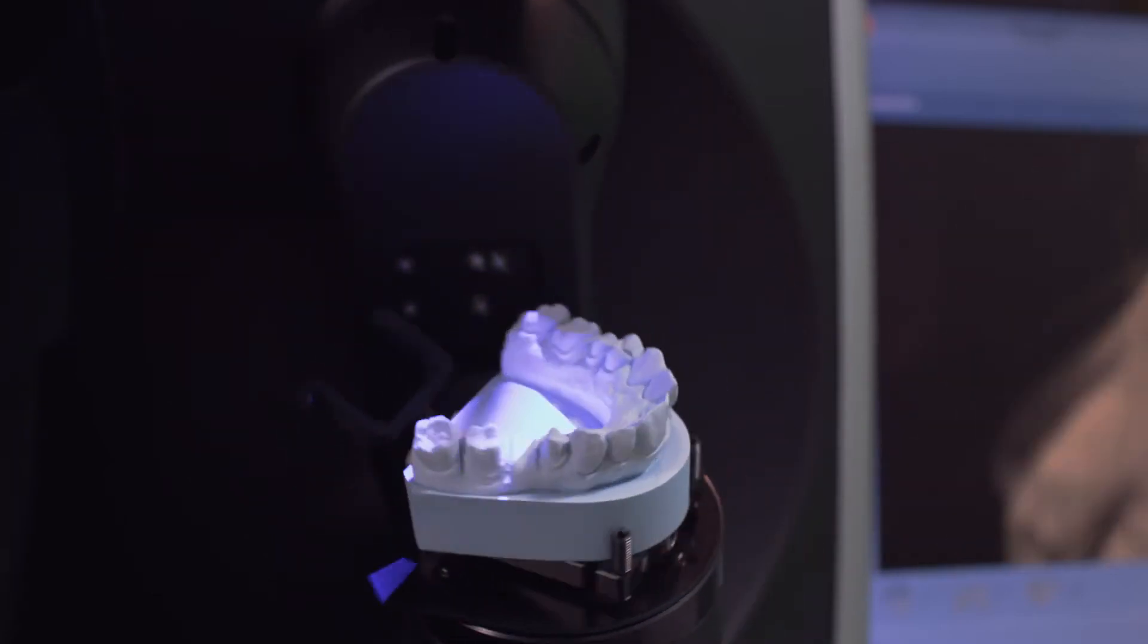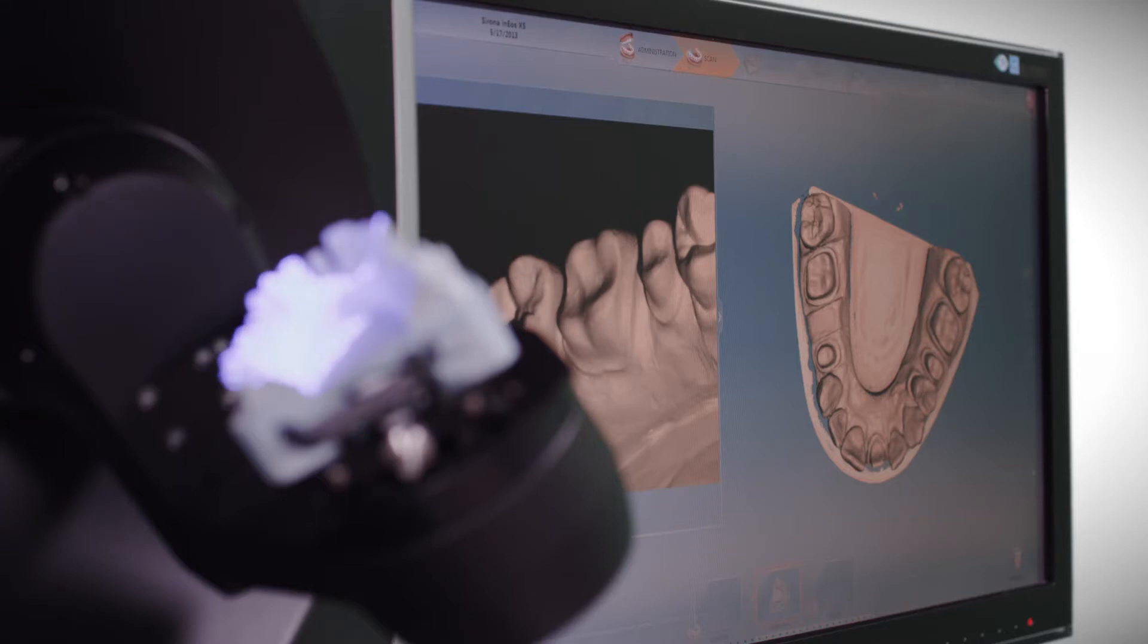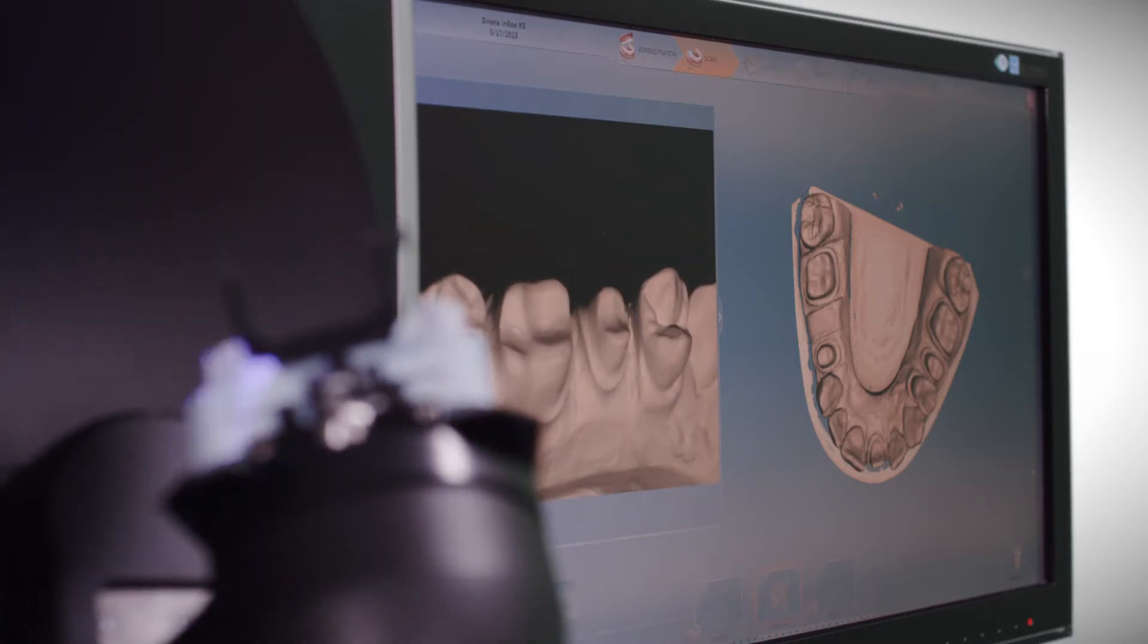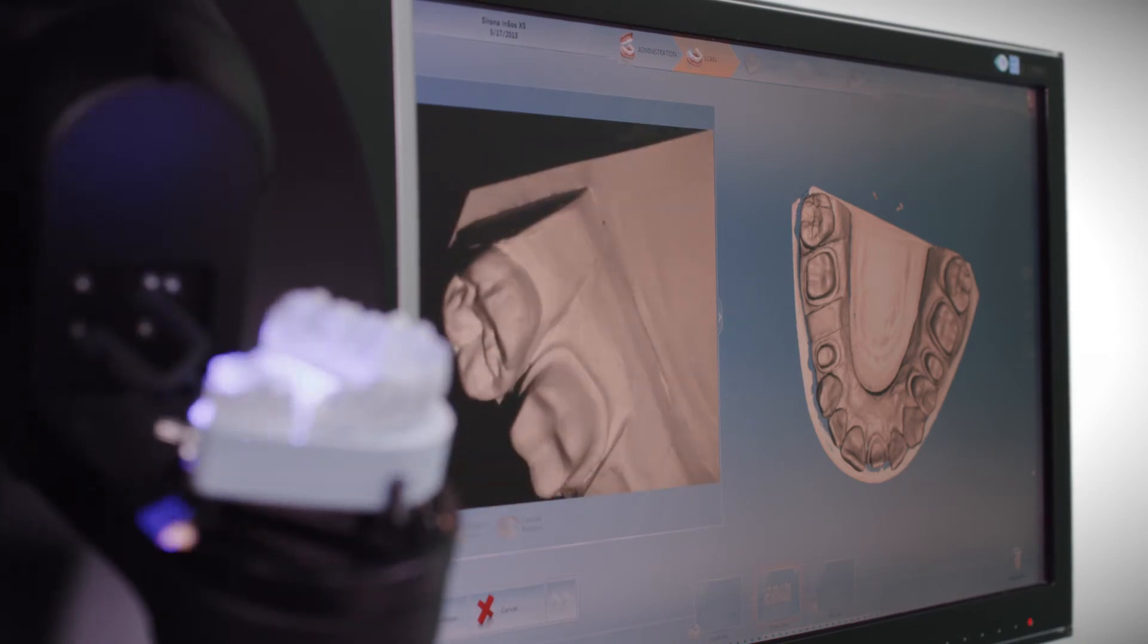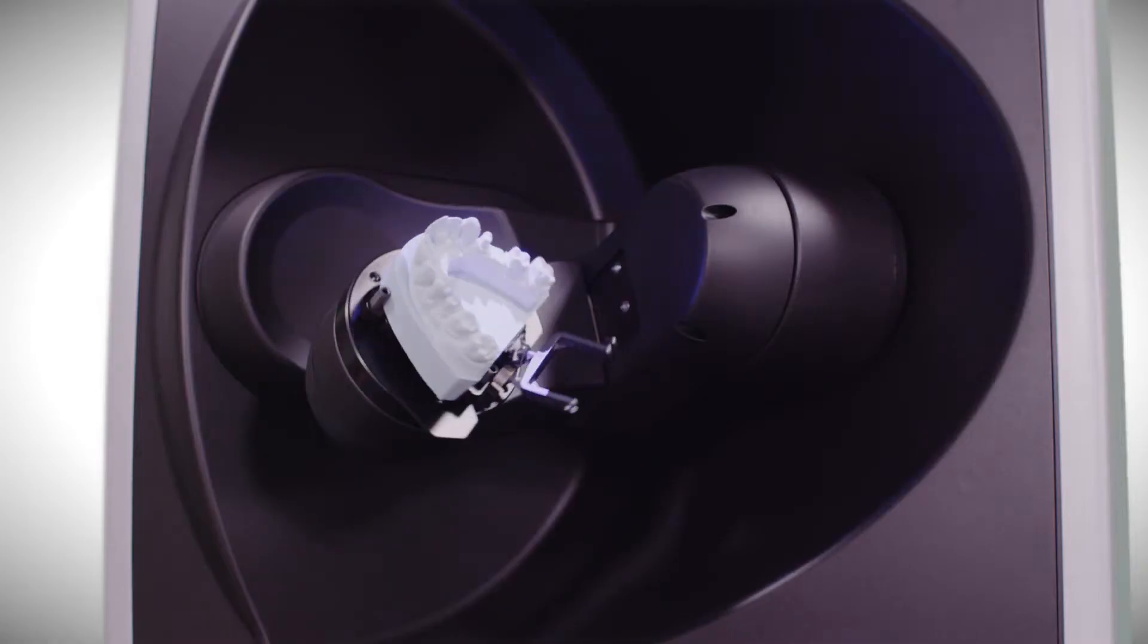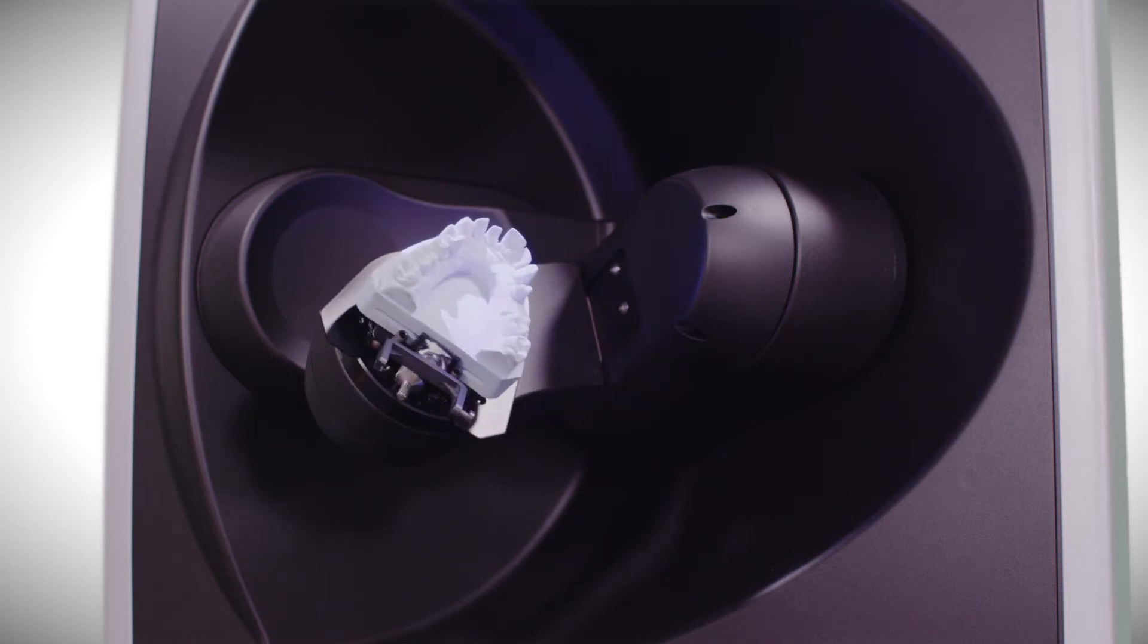The 5-axis technology with robotic arm ensures quick, automatic positioning combined with an autofocus feature. Simply select a particular area of interest to acquire, use the point and shoot feature, or combine scanning techniques. This innovative scanning technology offers outstanding precision at less than 12 microns and impressive depth of field.